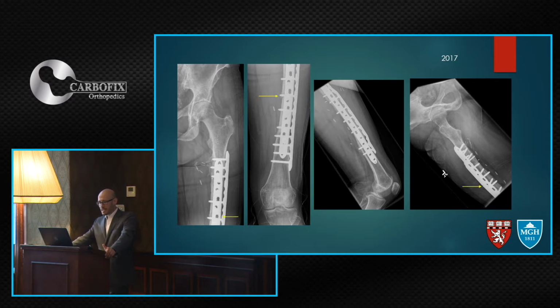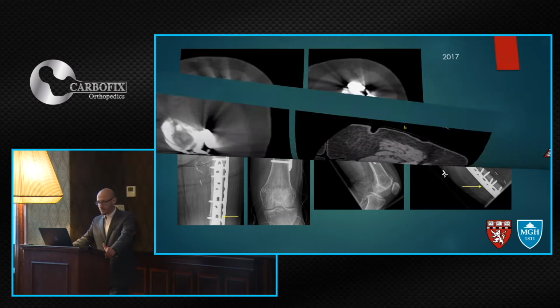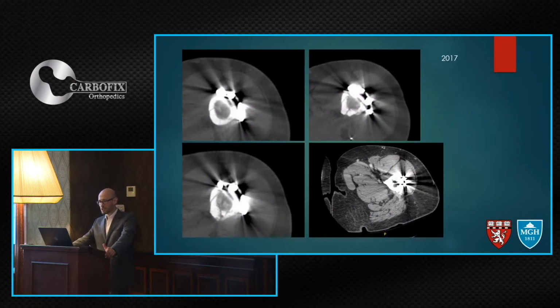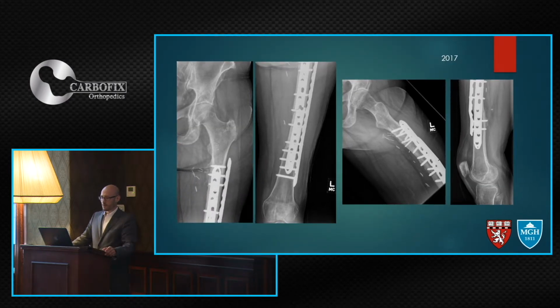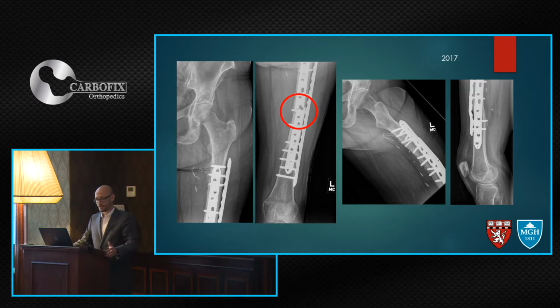that raises the concern of a fracture, but she still can't bear weight. We get a CT scan, and then we identify a fracture of the allograft, and then we have to change the whole allograft. In my experience, the results in the long term with intercalary metal prosthesis are extremely poor, and this patient is basically disease-free, is a cancer survivor. And overall her health is good, and she's not on chemo at this point, so an allograft will be an option and could heal with a better chance than it did when Dr.